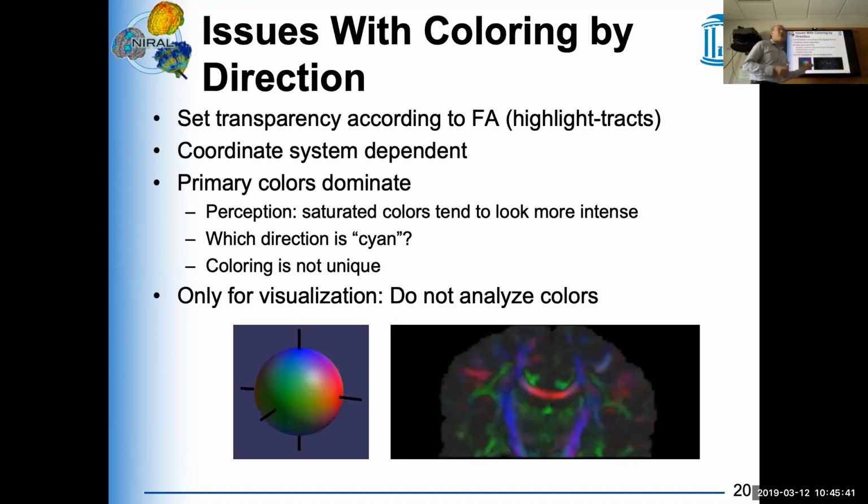They're of course very much related to our visual system, which is not uniformly sensitive to different colors, and then we have people who may be green-red blind, so lots of this stuff looks the same. Our vision is not very good at using these colors for any kind of visual diagnostic, so radiologists will not use this for diagnosis.